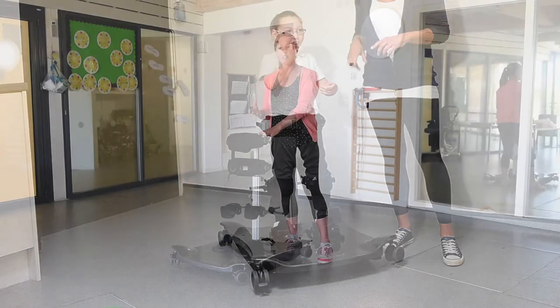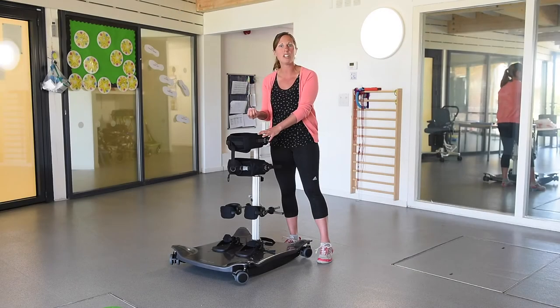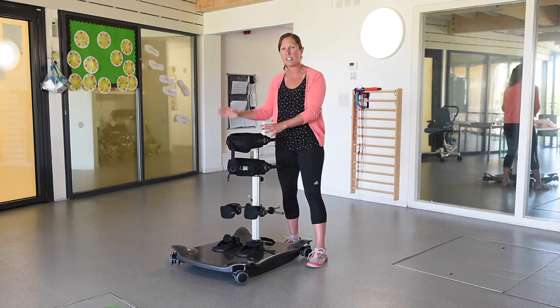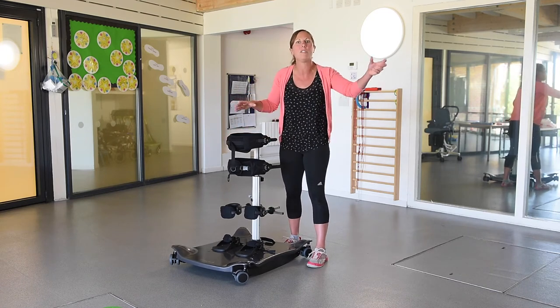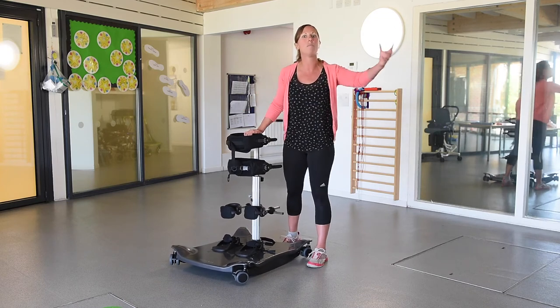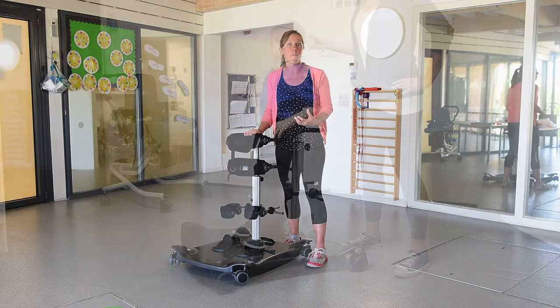As they become more confident and start to gain a midline position, we then start to challenge them a little bit more and get reaching outside their base of support. We get that at a nice level that's easy for reaching for them. So we're challenging them with that balance with the rocker, getting them to move outside their base of support and come back to centre.